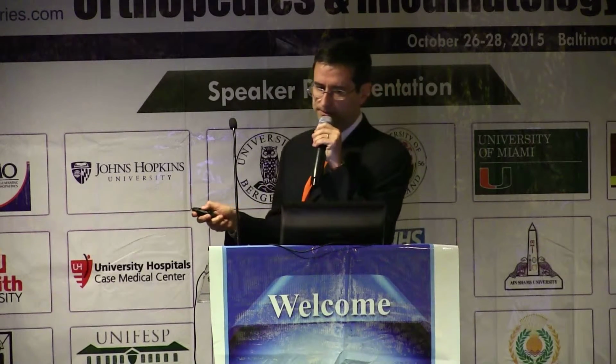The most common abnormality of the median nerve is the reduction of its echogenicity, becoming darker. This change is due to the presence of edema that is seen close to the compressed segment of the nerve.